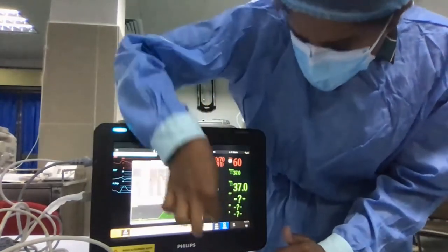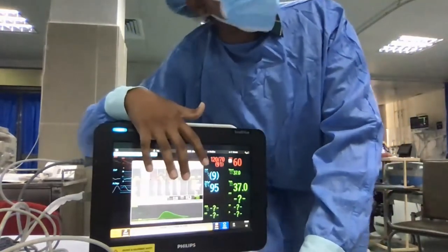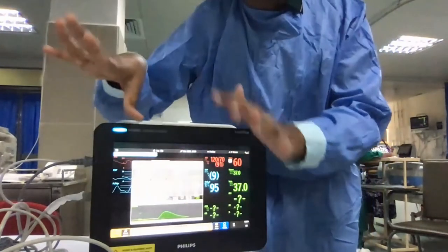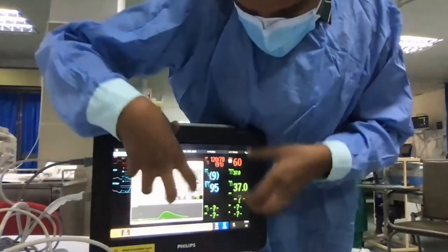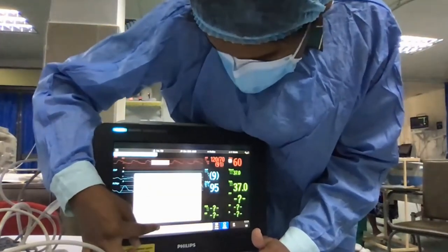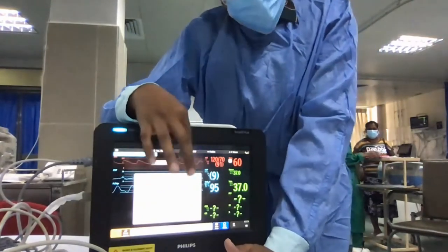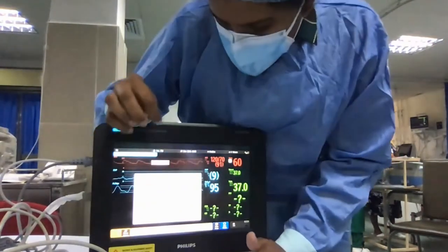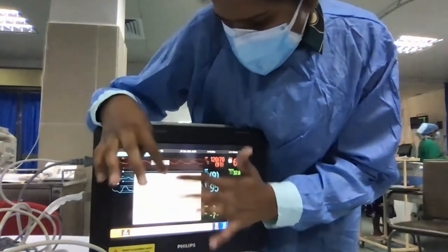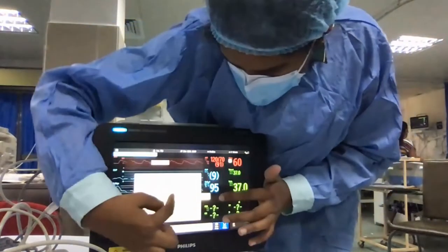Now we'll go to the hemodynamic calculations. This is where this PiCCO screen is very useful. Otherwise, you will have to select hemodynamic calcs from here, and then only will it display all the values. We will upgrade this to a PiCCO monitoring screen. So click on hemocalcs, and you will get all the calibrated parameters over here. If you have any doubt what an abbreviation stands for, you can just click on it and it will show you the long term.